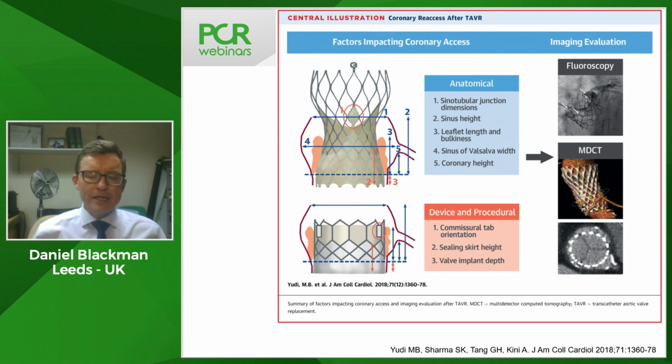We've certainly done that, particularly in urgent and emergency cases where we've faced a combination of severe decompensated aortic stenosis and left mainstem disease, where we've done the PCI and the TAVI at the same sitting. And often then we've elected to put the valve in to stabilize the patient and then do the PCI. Because that's the counter argument to doing the PCI up front: if you have a complication during the PCI and you have a patient with untreated aortic stenosis, they're less likely to tolerate that. But I would argue in general PCI up front, but you have to treat each patient individually.